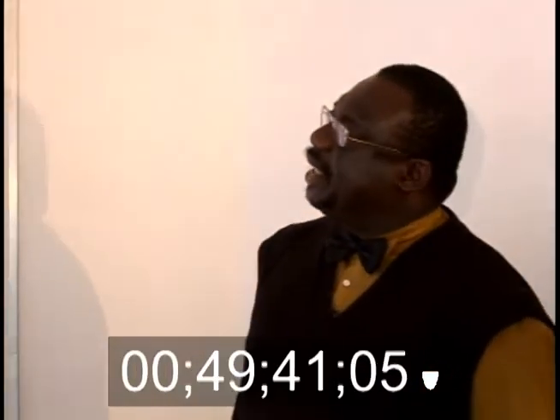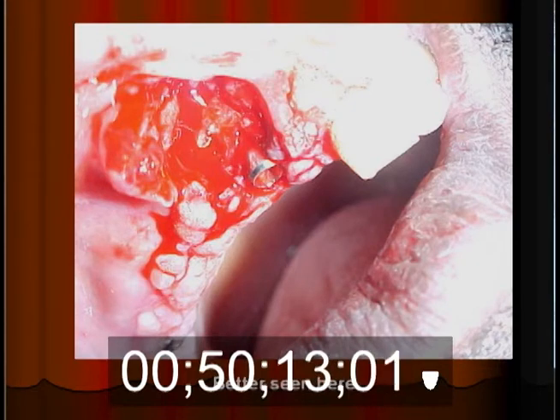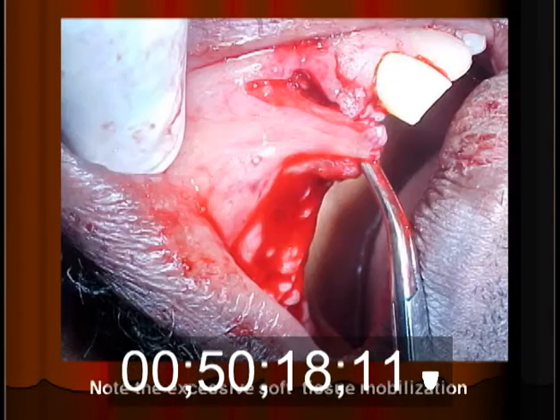But then I looked again and looked again, and I saw a retained root adjacent to the implant. The retained root was in such a presentation that it was upside down. So this is going to take us to history now. I looked again, didn't see anything.